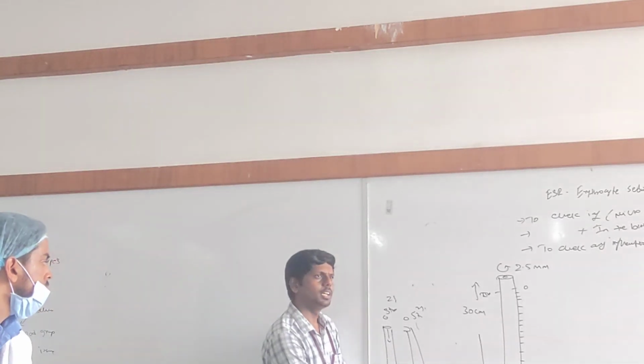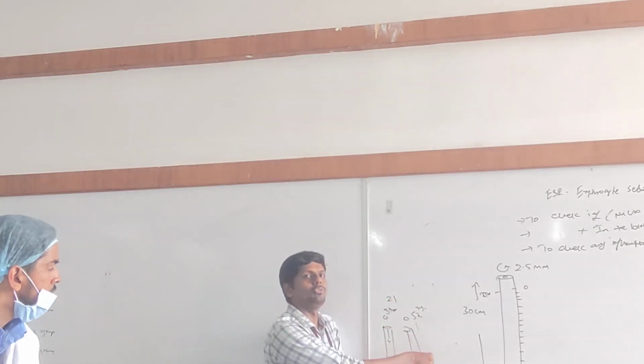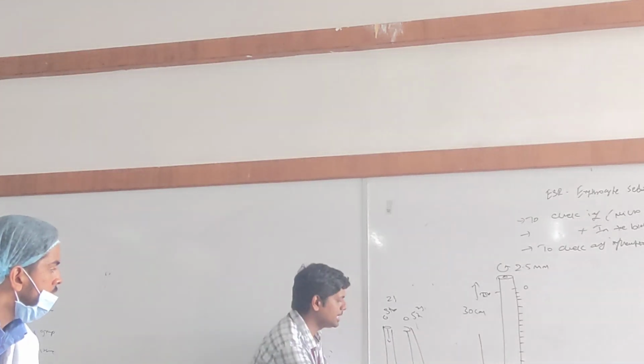More than this time, right? Maybe can I wait 10 seconds? Because it is slowly moving through the fevicol. Okay? Once it settles down, that is called sediment.